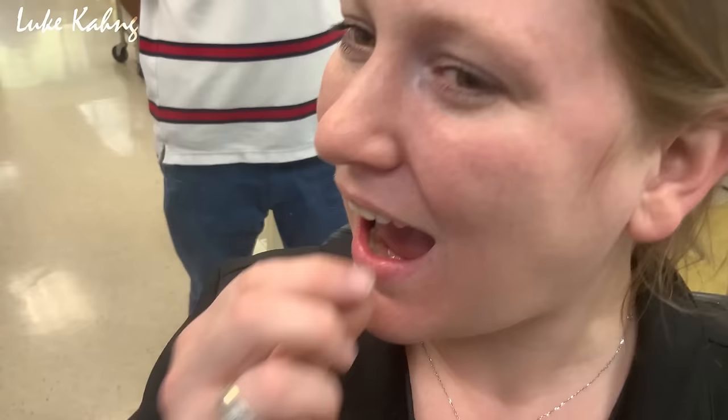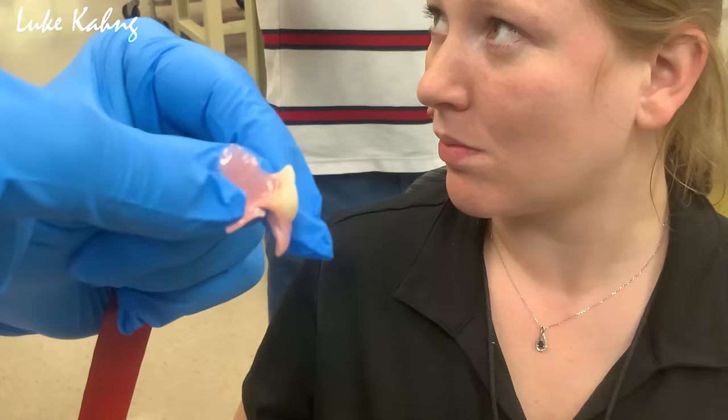Let me see. Okay. It's hitting a little bit here. Canine. Go ahead and, yeah, it's hitting the canine. You can go over there. A lot of complaints.